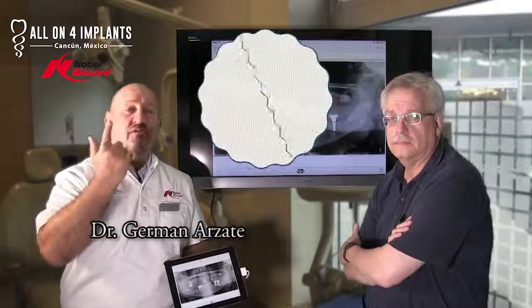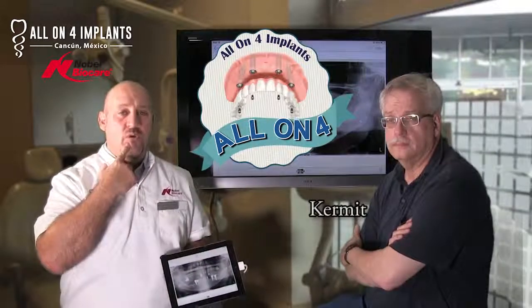Hi everyone! Today I have here another great case of All-On-Four. We did All-On-Four on the uppers. We did a hybrid screw retainer bar on the lowers.